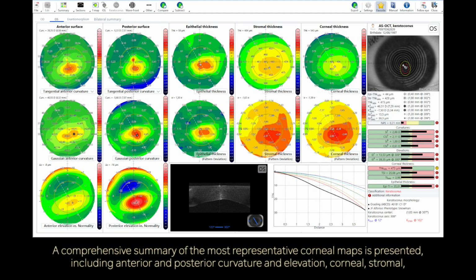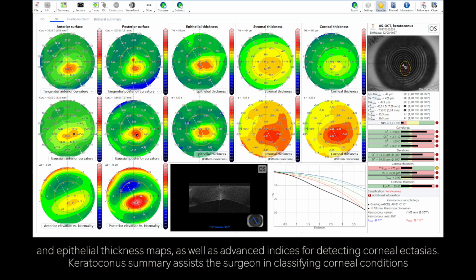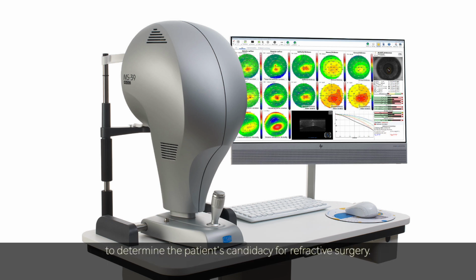A comprehensive summary of the most representative corneal maps is presented, including anterior and posterior curvature and elevation, corneal, stromal, and epithelial thickness maps, as well as advanced indices for detecting corneal ectasias. Keratoconus summary assists the surgeon in classifying corneal conditions to determine the patient's candidacy for refractive surgery.